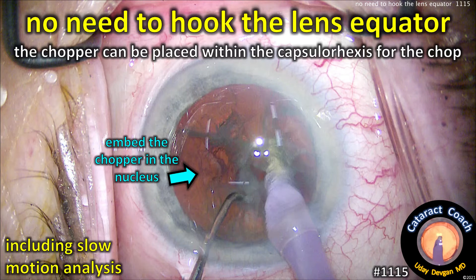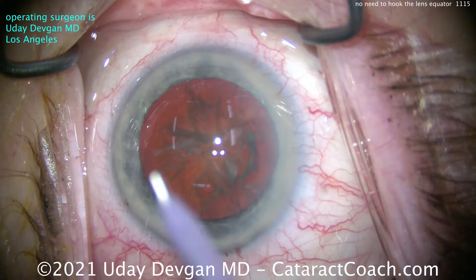CataractCoach.com. There's no need to hook the lens equator. You can simply place the chopper within the capsulorrhexis and into the nucleus and still achieve the chop.